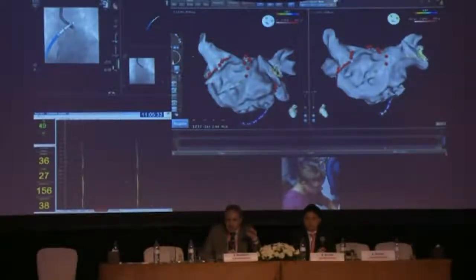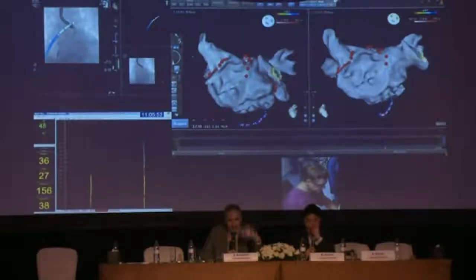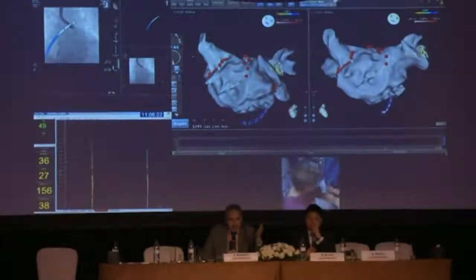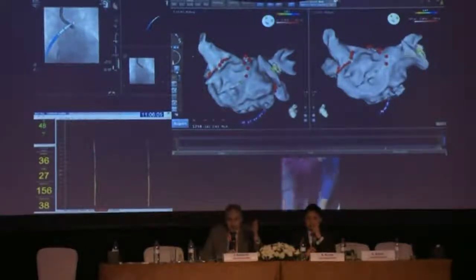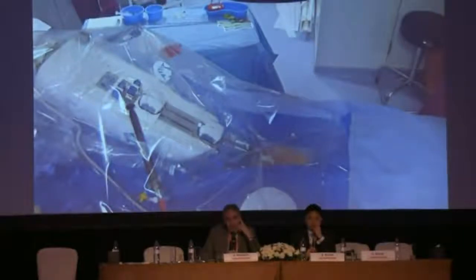That's important to emphasize, that once you start to do some linear lesions, you have much higher risk that you will have recurrences, not of atrial fibrillation but some regular atrial tachycardias. And these could be even worse tolerated than atrial fibrillation. So sometimes patients are really unhappy because they have 2-to-1 conduction, a relatively rapid heartbeat that is regular. So they come back and they complain that they are even worse than before the ablation. So this is also now our strategy, not to ablate too much, or once you decide to do a line, it has to be really a line that is with block.